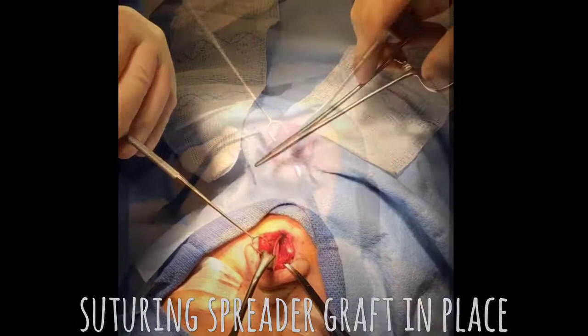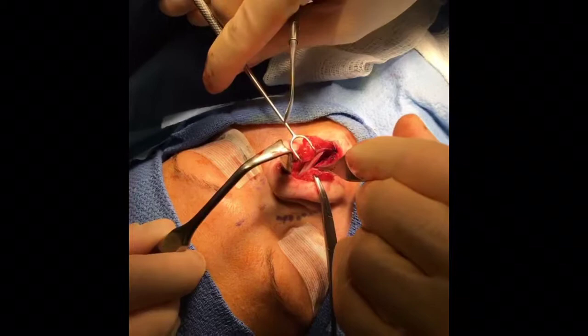As you can see, there are two layers of cartilage now. Once we take this tension out here, that septum will straighten.